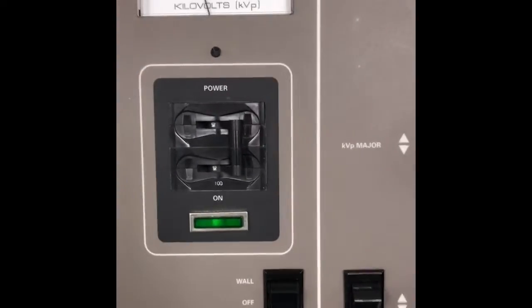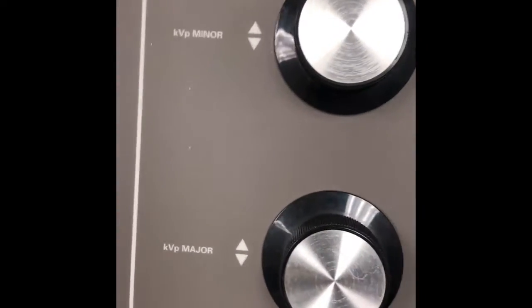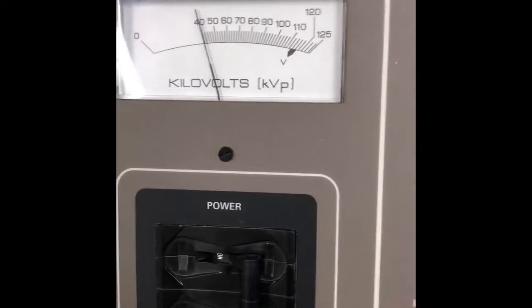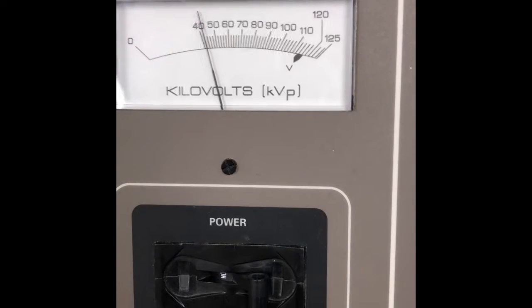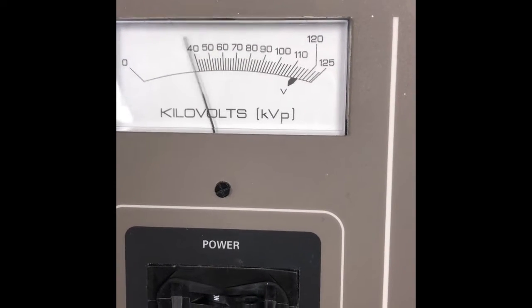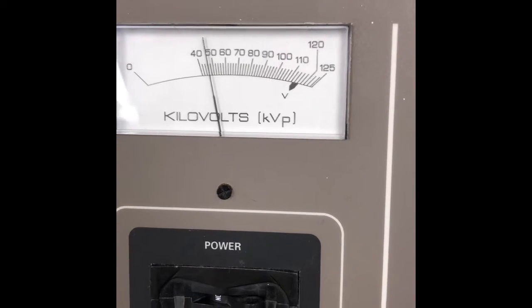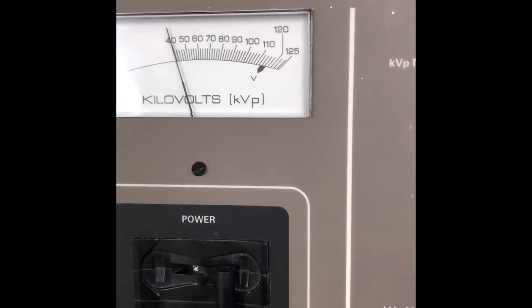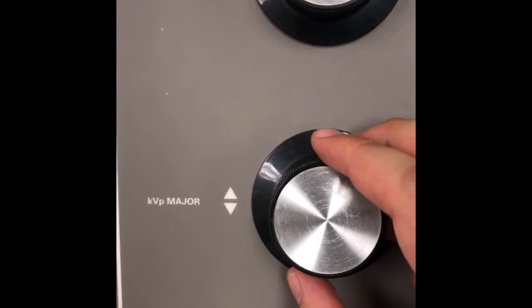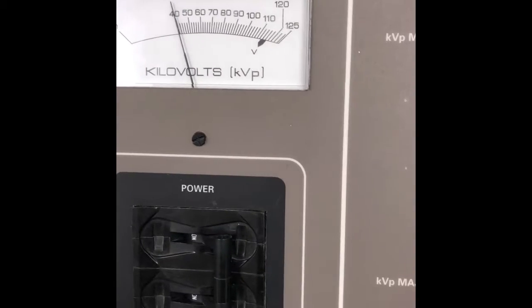But on here, you can see we have the kVp selectors, the minor and major. And when I turn the minor, you'll see that the kVp increases by about 2. Now, when I change the kVp major, it will increase by about 10.